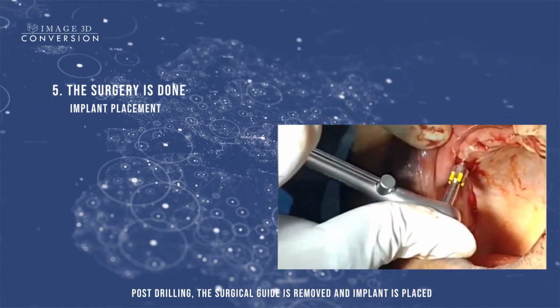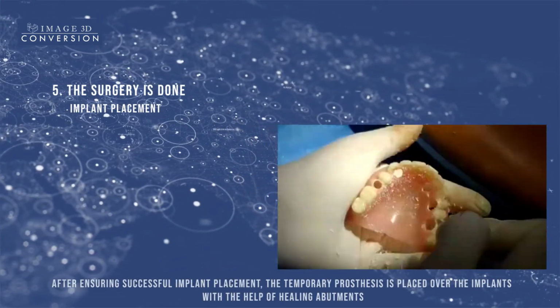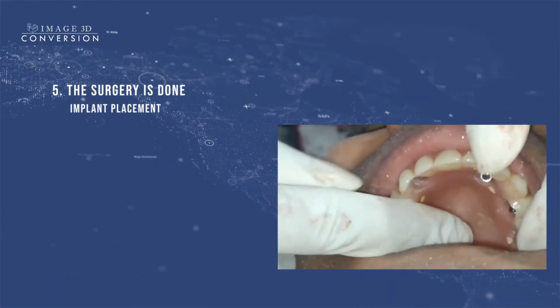Post-drilling, the surgical guide is removed and implant is placed. After ensuring successful implant placement, the temporary prosthesis is placed over the implants with the help of healing abutments.